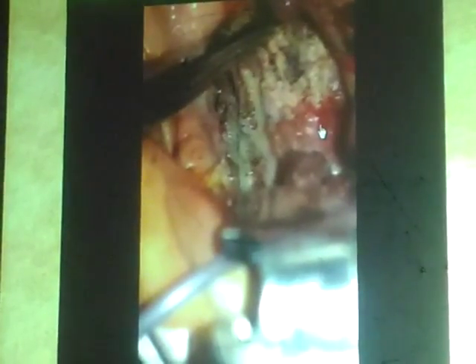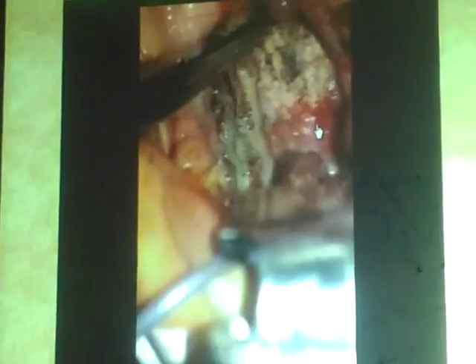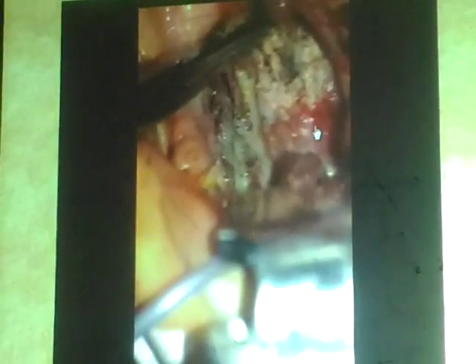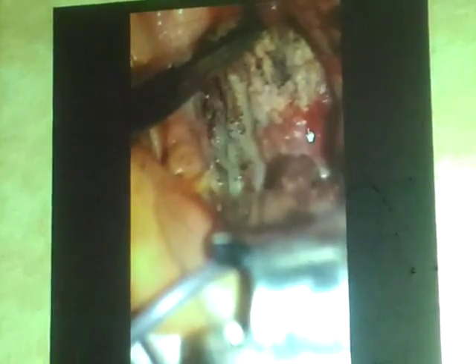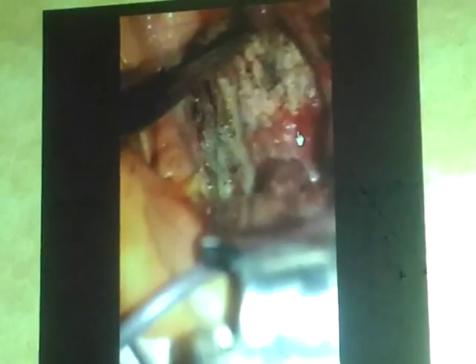This is the same way that you're going to see it if you stand to the side of the patient face to face. Don't do the procedure while you are at the head. You will do it blindly. You cannot see the bed. You cannot see your operative area.